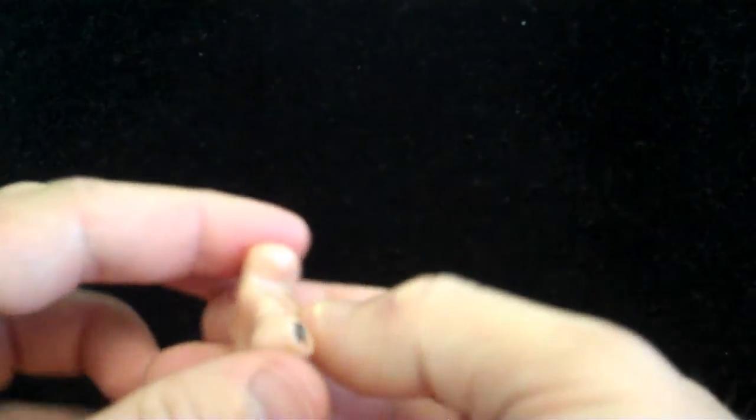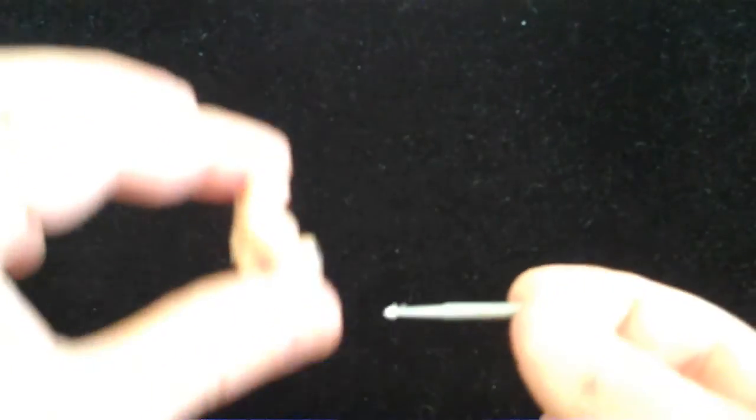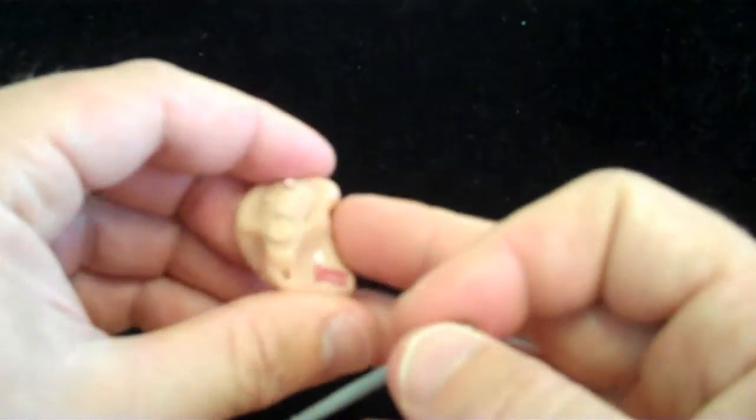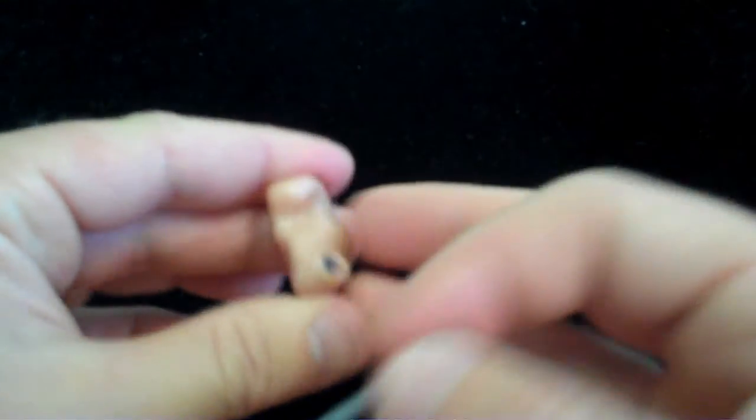Now, the same procedure is used with custom hearing aids that have a wax trap. Not all of them do, but if they do, that same white basket sits right in front of the receiver. There you go.